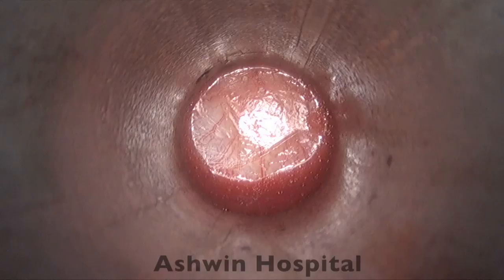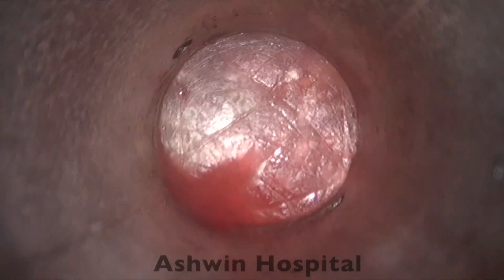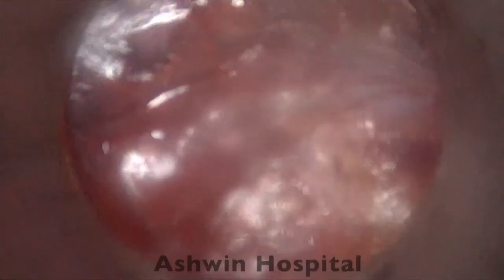We will start with the standard TEP repair. Generally, we should not go in the midline. We should enter to the right or left of the midline. So here we are entering into the right side, into the retrorectus space. That white sheath was the posterior rectus sheath.